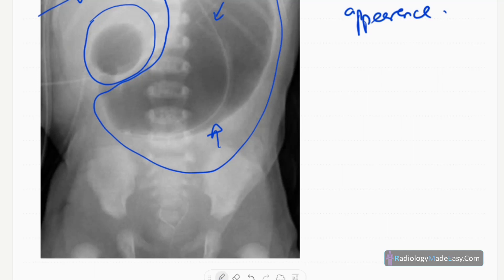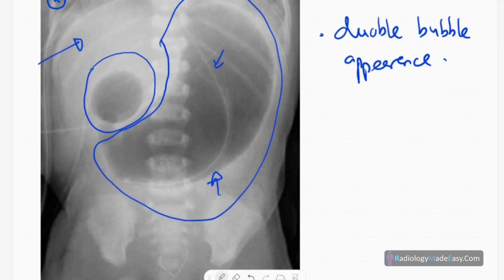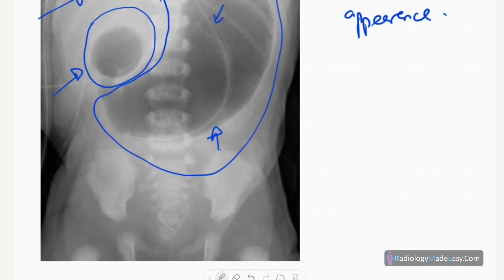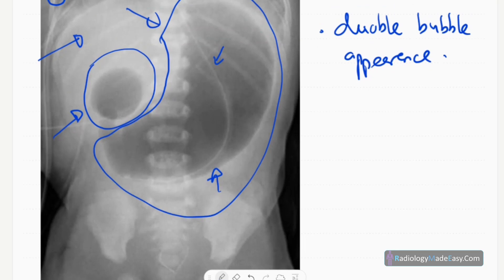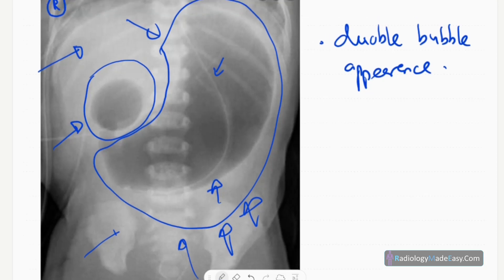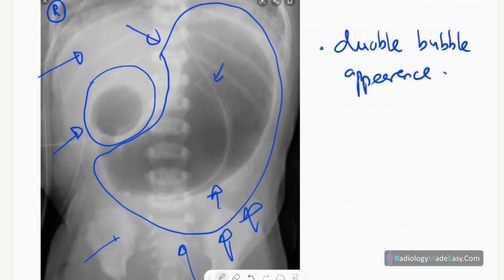This is the stomach and this is the first part of the duodenum — both dilated. We can't see any distal bowel loops here, so this is a proximal bowel obstruction. The distal bowel loops are collapsed and there are no complicating features.